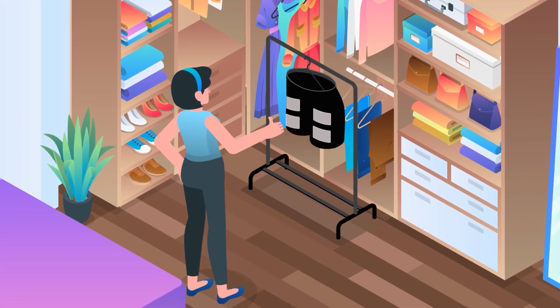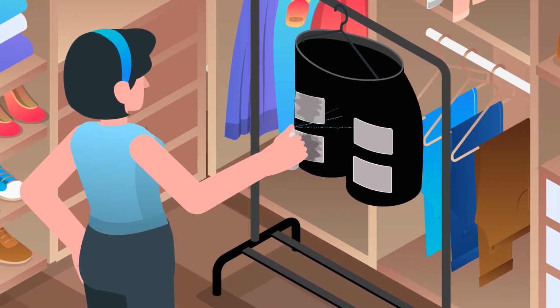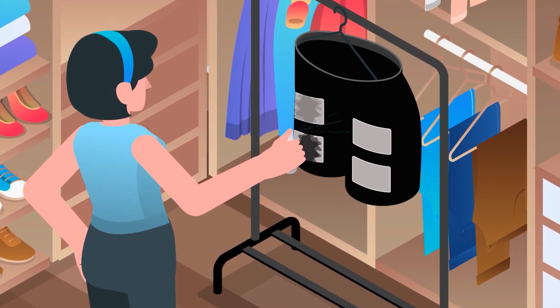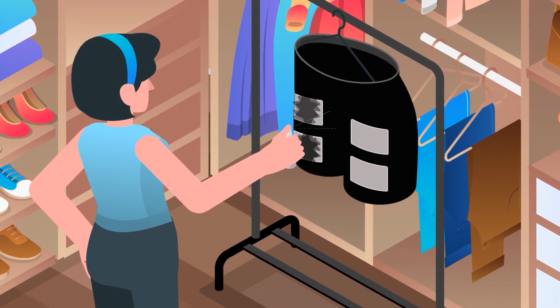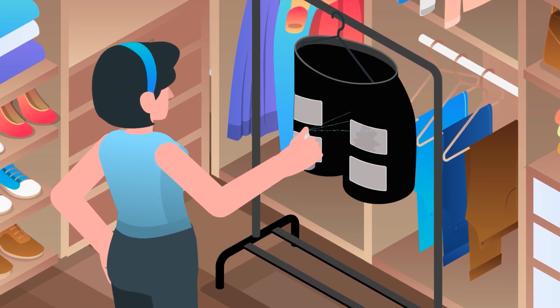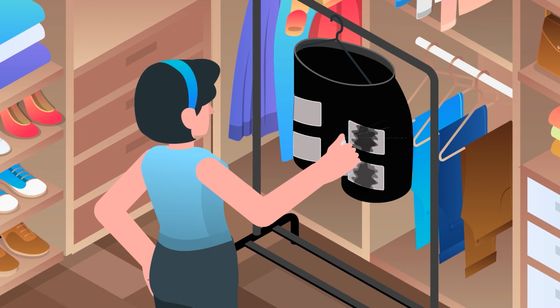Turn the shorts inside out so the electrodes are visible. Hang shorts up prior to using the spray. Remove the cap from the spray bottle. Hold the bottle 6 to 8 inches from the shorts. Thoroughly coat each panel with at least 3 sprays to ensure even coverage. Make sure to spray all 8 electrodes. Please note that the shorts will be damp.